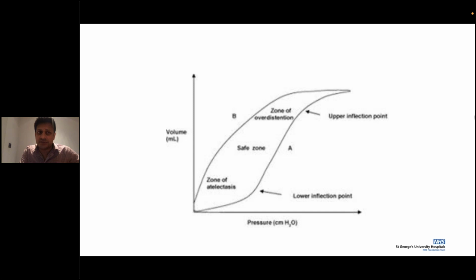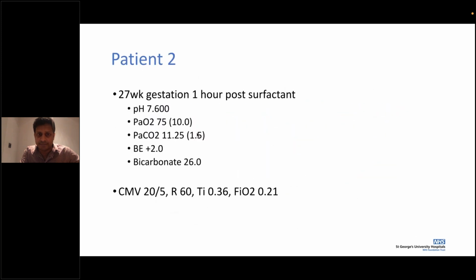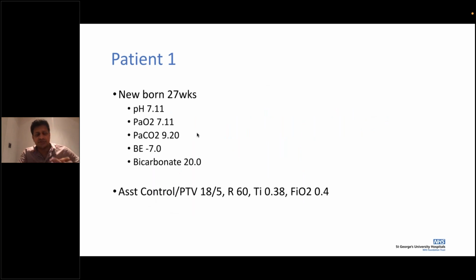Yeah, so let's start with the first one. I deliberately put very few cases because I was quite conscious about the time. So if we go back. Okay, patient 1. You've got a newborn baby, a 27-weeker, and that's your blood gas. This baby is just born and ventilated, on PTV, which means all breaths are supported. That's your blood gas and that's the pressure that is required. Can you fire away with some of your thoughts?